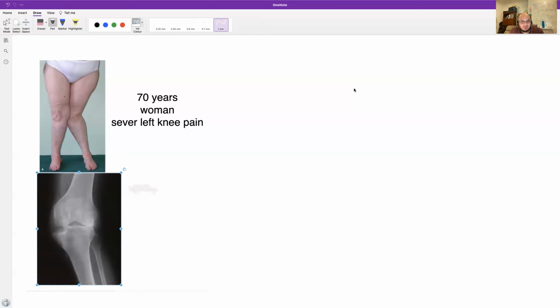If it is completely intact, I would go for a PS knee with patellar resurfacing, a cemented implant. If it's deficient but still intact, I will do a condylar constrained knee. If it's completely deficient, I should have a rotating hinge knee replacement. As a rule of thumb, for any level of constraint or augmentation, I should use supplementation on the femoral and tibial side with stems.